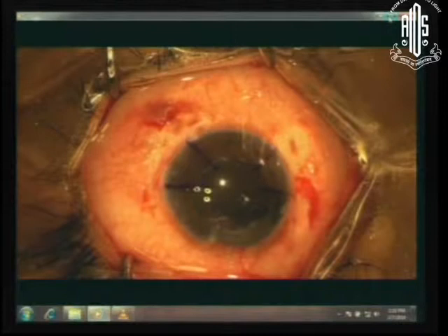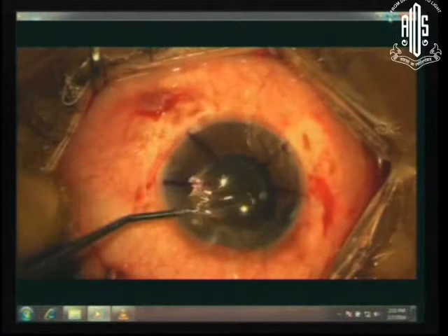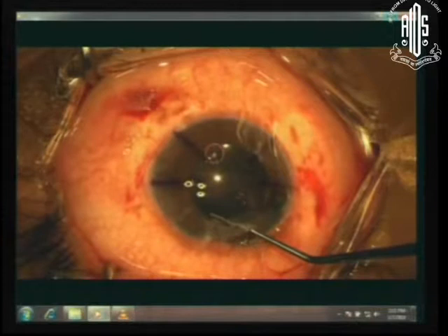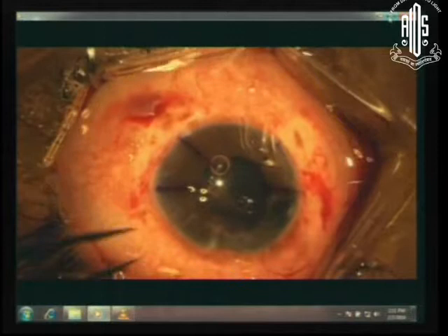You still leave it in the anterior chamber — don't put it back yet. The next step is to rotate the lens around so the other loop comes out, then gently remove part of the loop. Here the entire loop is slipped out but it doesn't make a difference. Remember to always tie it at the point of maximum convexity of the loop, because that is the point which you really want to slip in. Now you rotate it in and then pull both sides, because the lens has to rotate back into its place — which it will do. Now we have a perfectly positioned lens.